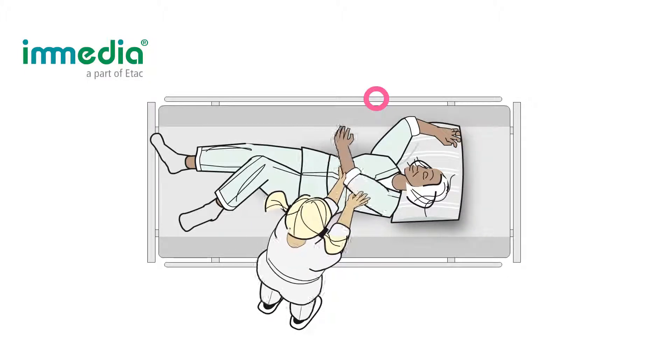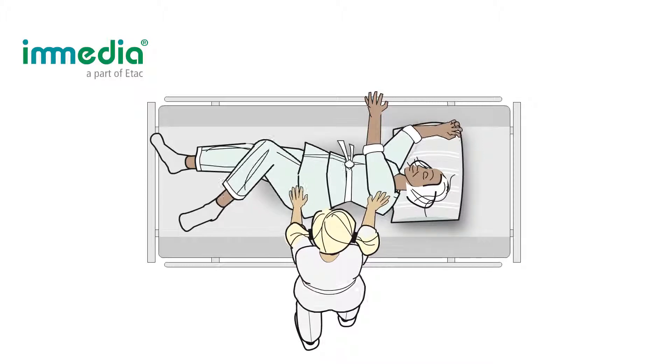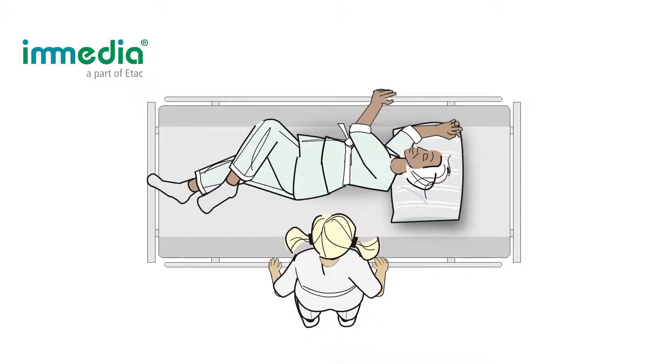Ask the patient to grasp the gate on the right side and log roll towards a lateral position. Assist the user if needed.